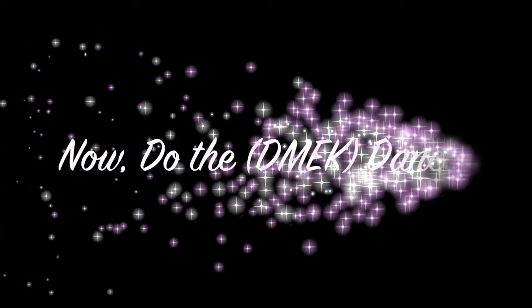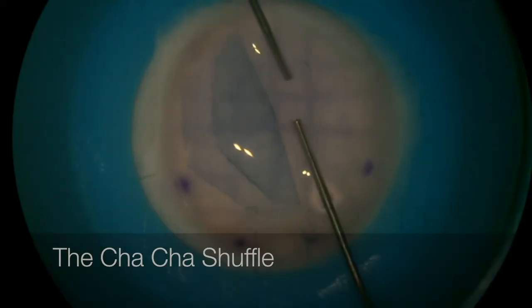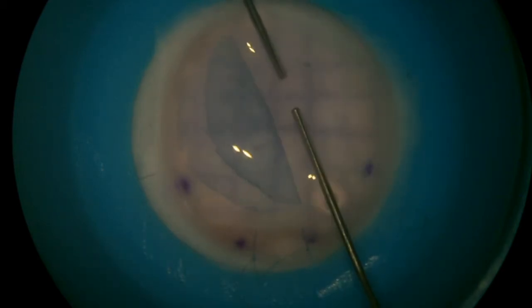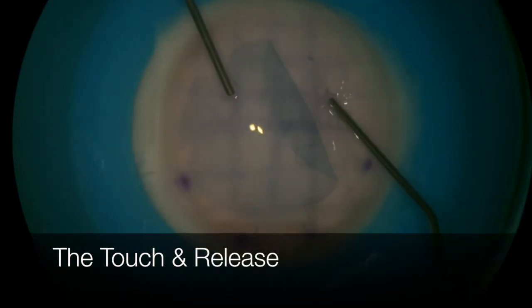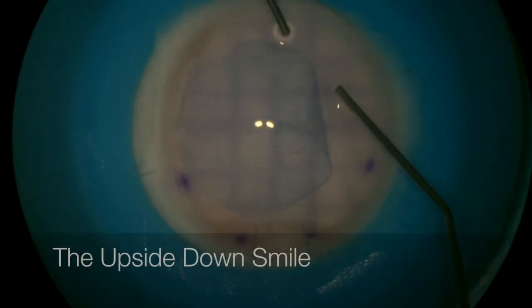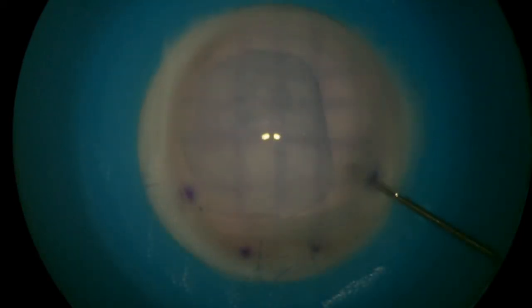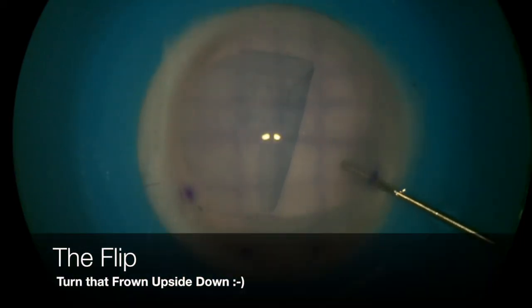Now let's look at what kind of dance moves you can do on the DMEK practice dance stage. You can do the cha-cha shuffle. You can do the touch and release. And then you can open the graft upside down and flip the graft over.